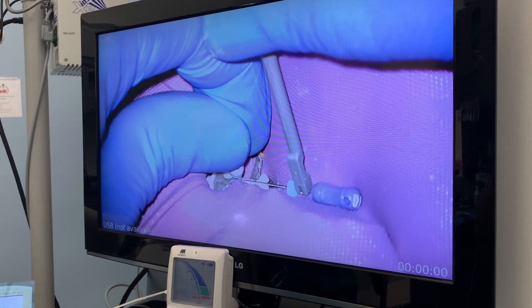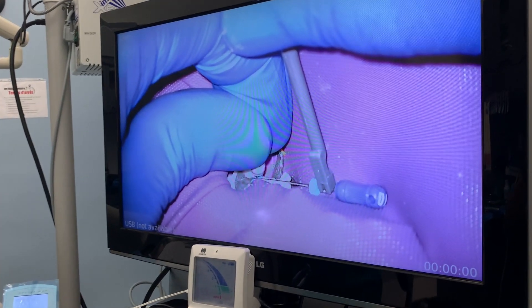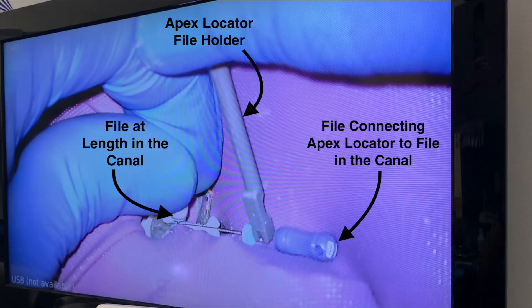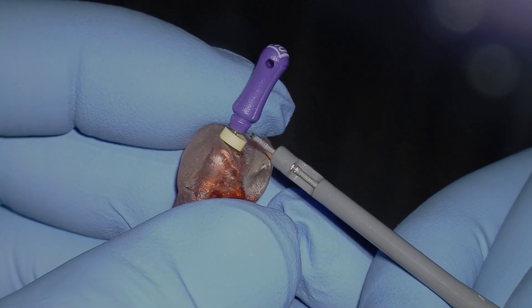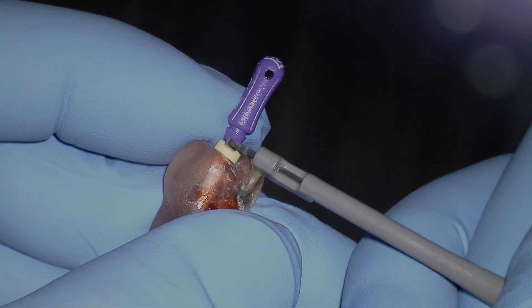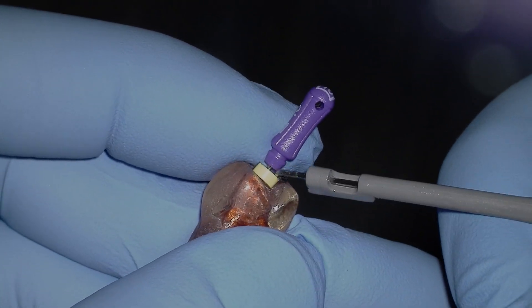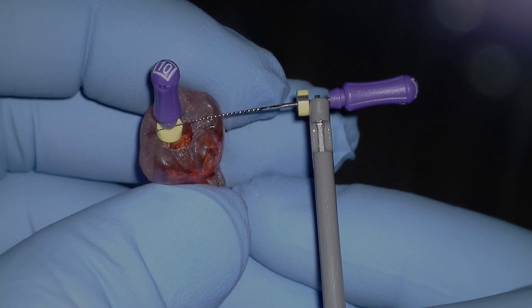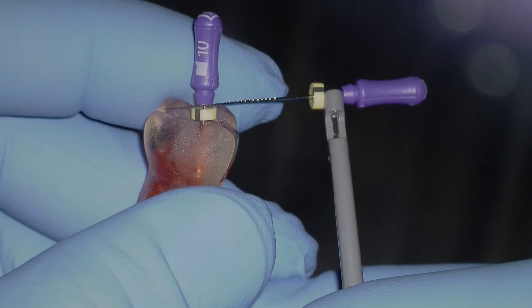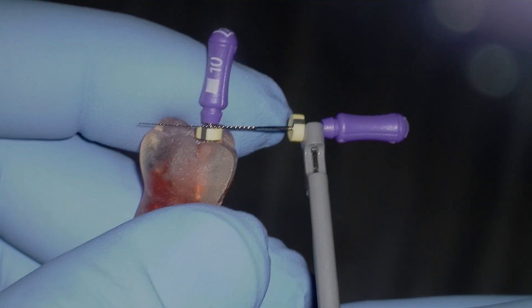I'm like, what are you doing, man? And it was such an incredibly simple, awesome technique to use when you don't have enough space to put your Apex Locator file holder on top of the tooth. Say, for example, you have sunk your 25mm file all the way to the Apex and there's not enough space to get your Apex Locator file holder. Just take a 10 file — you always have a 10 file or a 15 file. It doesn't matter what size it is; it's just fine enough to place it onto the Apex Locator and see if you're at length.